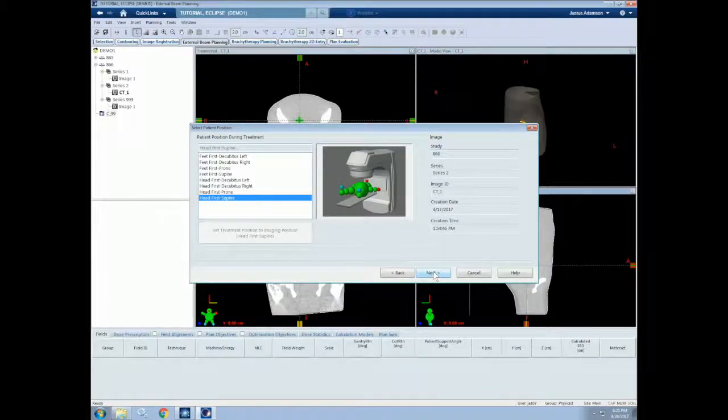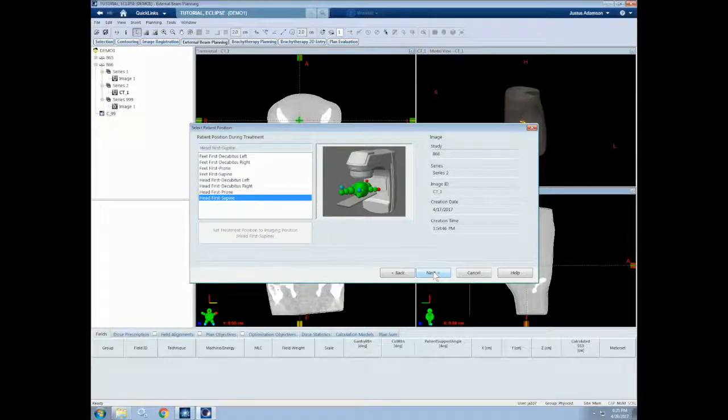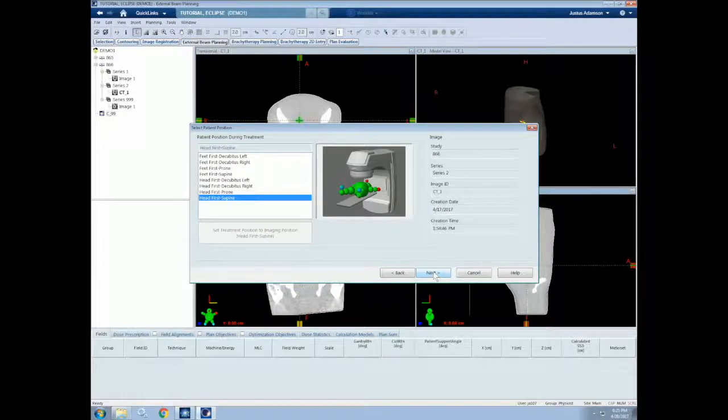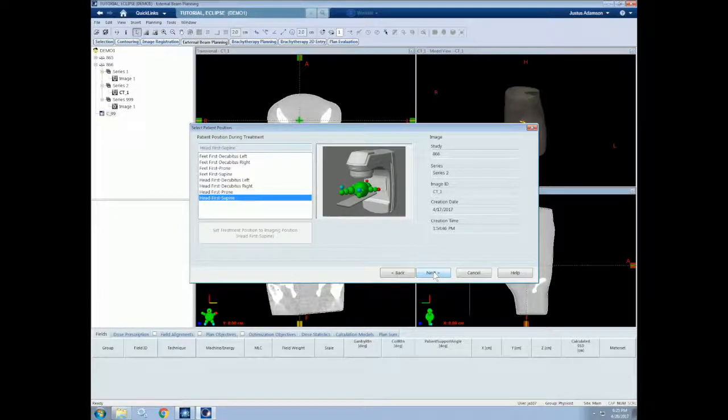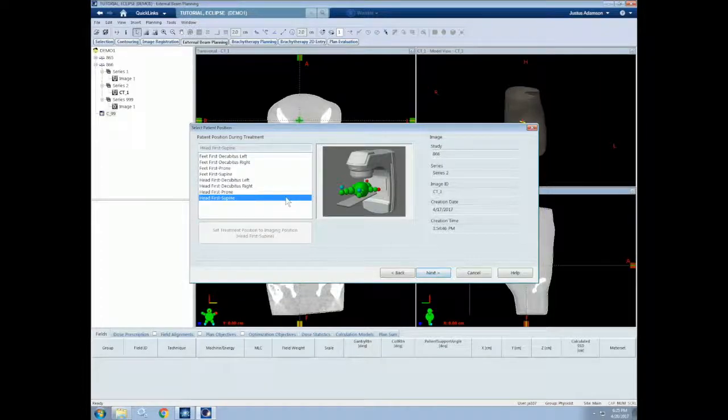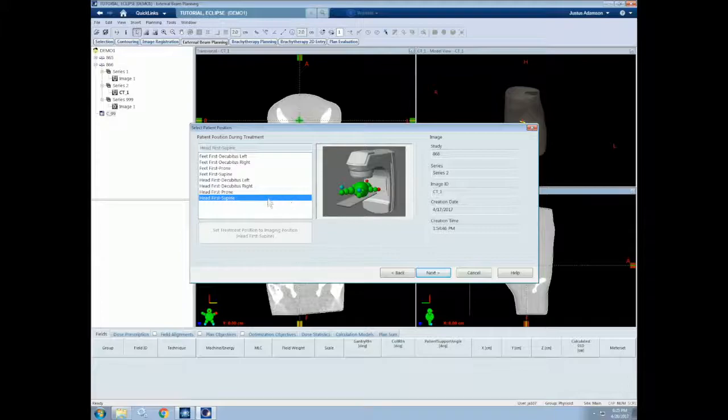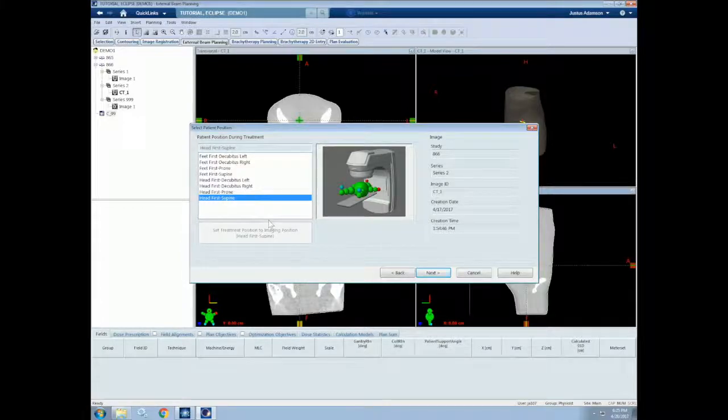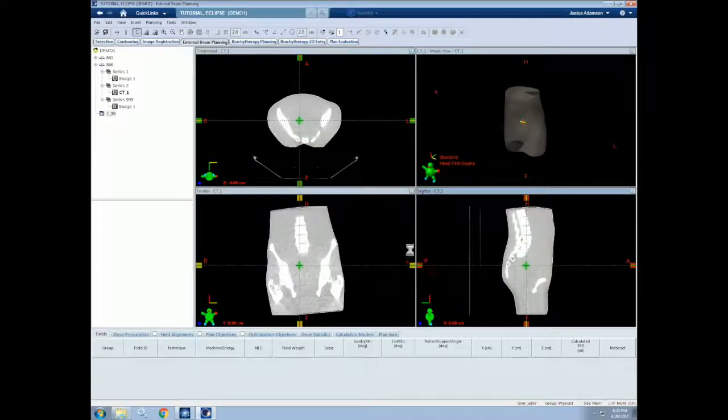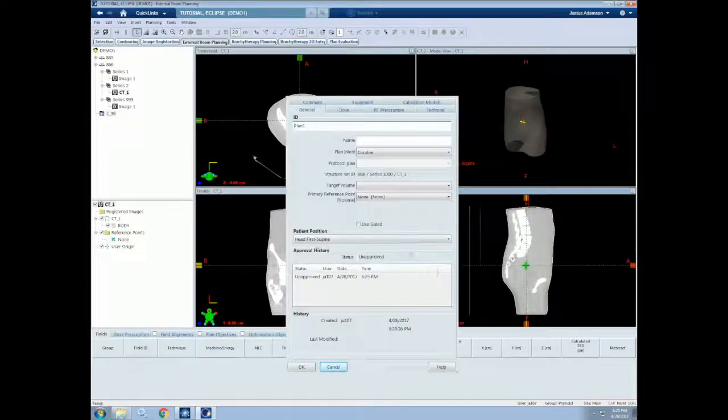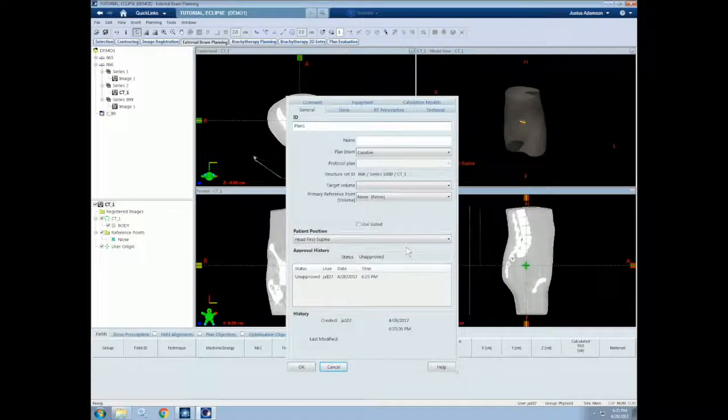We can now select a reference point, which I discussed in a previous tutorial. But since we don't have any, we'll just select None. Then we can select the patient positioning for during the treatment. This can vary based on the treatment site, the patient's limitations, and physician preference. We will select Headfirst supine, since this is the most common treatment position. But this treatment position should match whatever treatment position was used for the CT simulation.